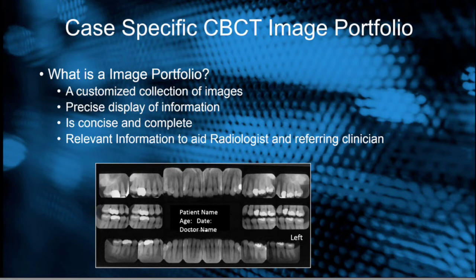So the case must be concise and complete. And this is relevant information specifically to that case to aid the radiologist in their radiology reports and the referring clinician, and also helping the patient understanding their needs.